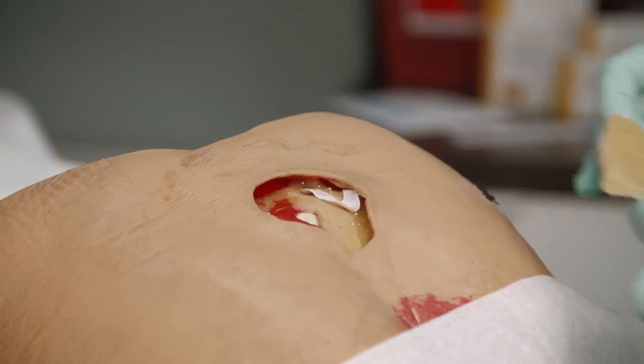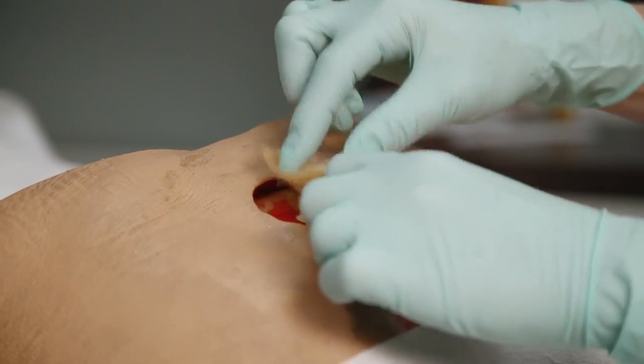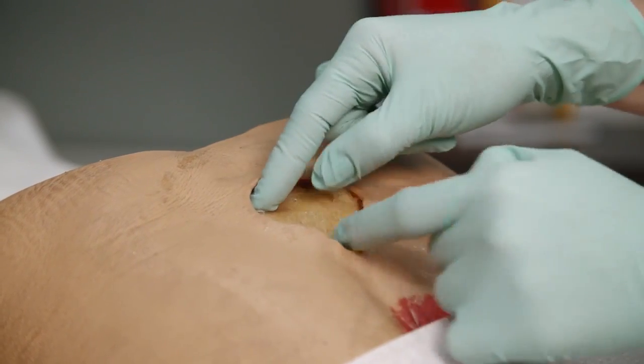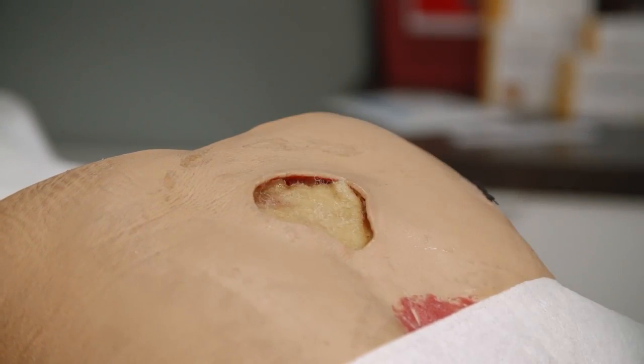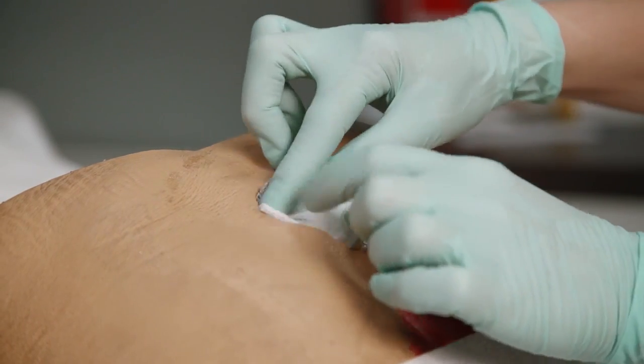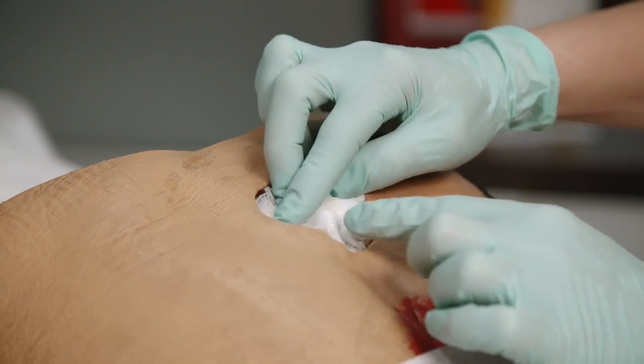Here, we add Medihoney calcium alginate to cover and fill the wound bed, being careful to keep the product inside the wound edges. If the depth of the wound requires it, gauze may be used to further fill the wound bed.